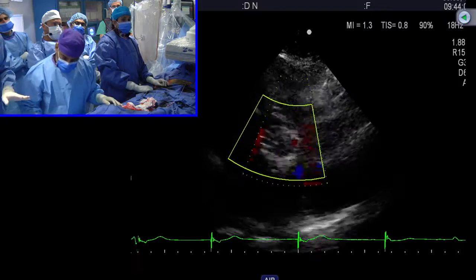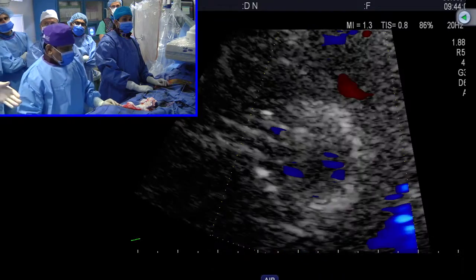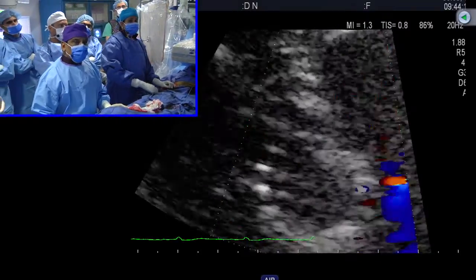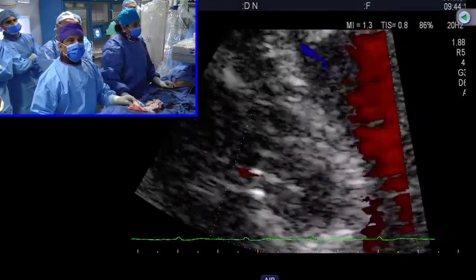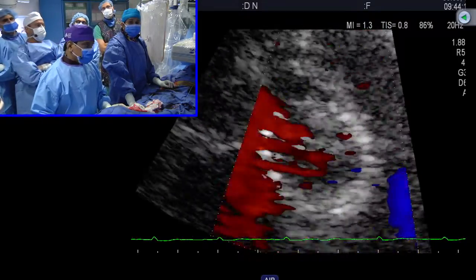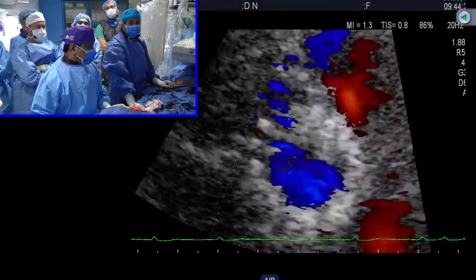To the mean diameter. Our mean was about 24.4. Yeah. So we were just below the mean. And if we go more than that, you see the valve is opening very well, plus the paravalvular leak regurgitation is gone. Completely gone. So I think this is a good dilatation.